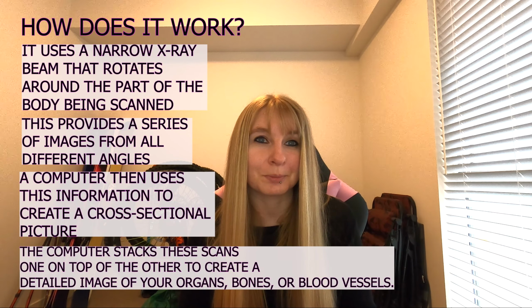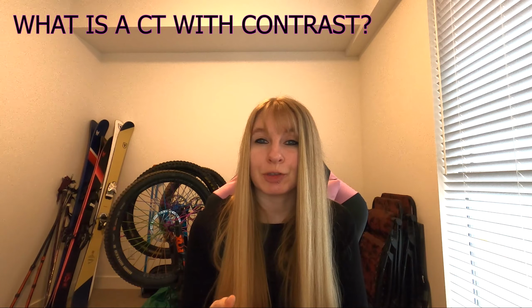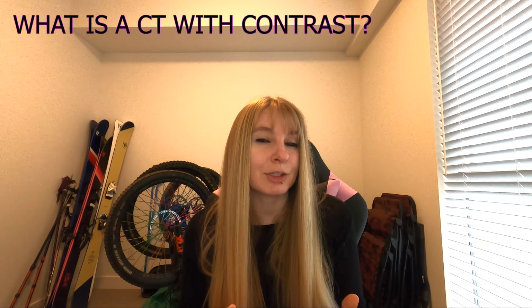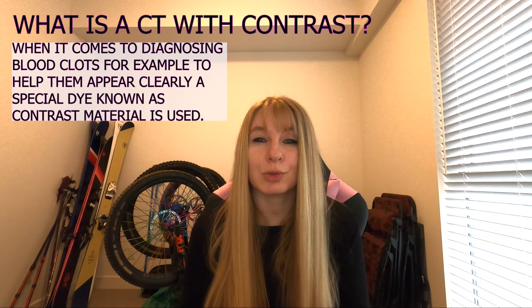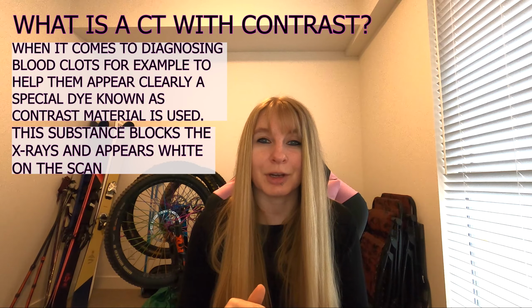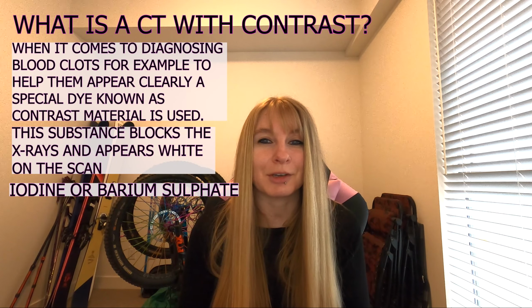Now, if you've seen my previous videos, you'll have noticed that when I've talked about a CT scan, I've always mentioned a CT with contrast. So what is a CT with contrast? In a CT, dense things like bone are easy to see, but in regards to those soft tissues and blood vessels, they don't show up as well and can be quite faint. So when it comes to diagnosing blood clots, for example, to help them appear clearly, a special dye known as contrast material is used. This substance blocks the X-ray so it appears white on the scan. Usually it's made up of iodine or barium sulfate.